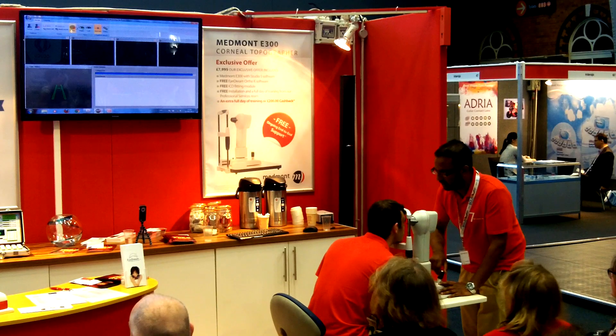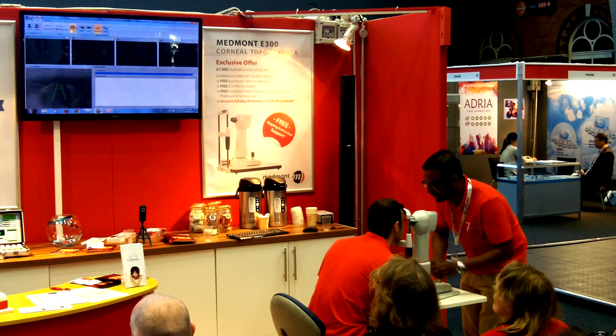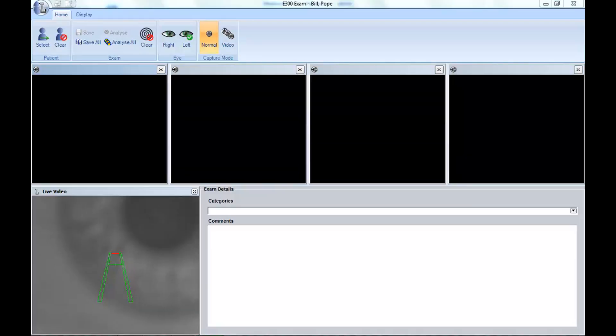We've done something very deliberate with Billy this morning. We've actually left Billy's soft contact lenses in situ, and what we're going to do, as we're taking these pictures, is look at these mires and see that they are not absolutely perfect. That will give you the information you need if you're ever doing any dry eye management, because this will show pre-lens tear film and very early tear film breakup times.